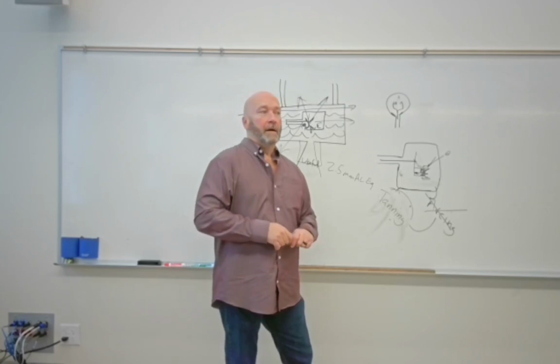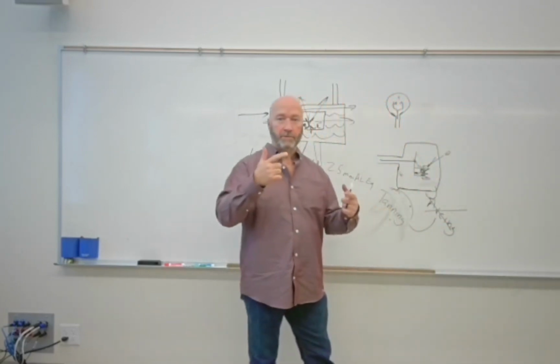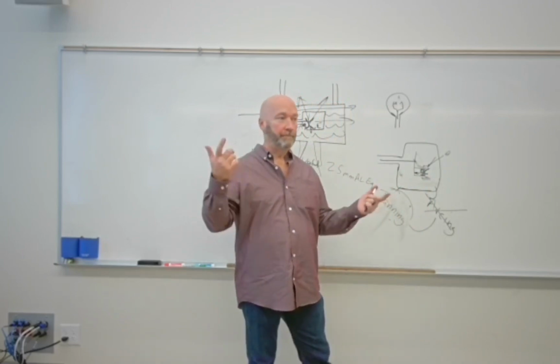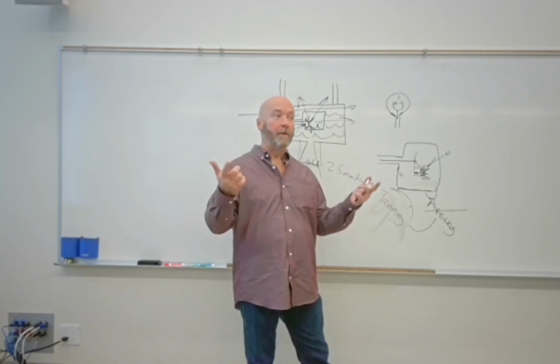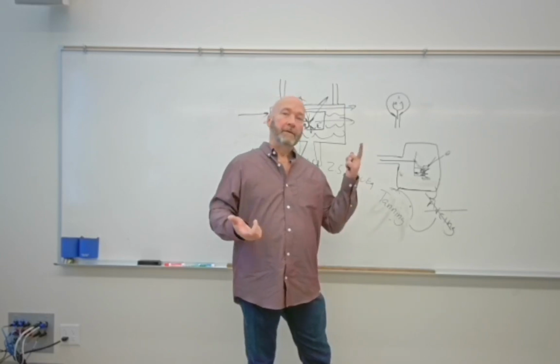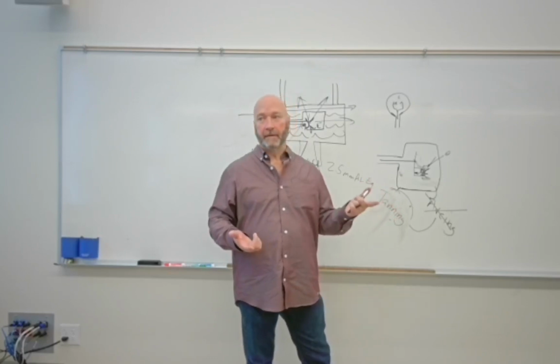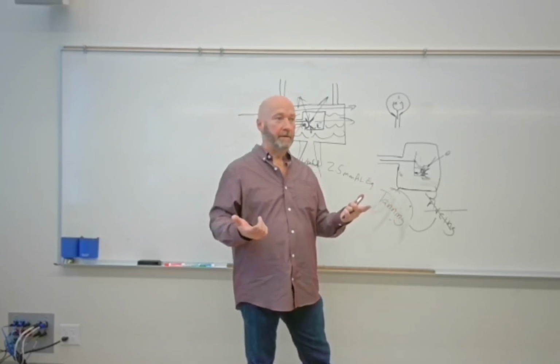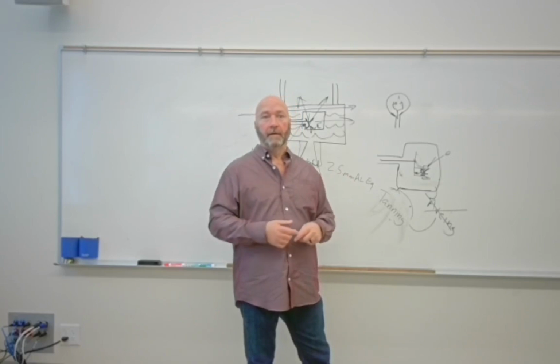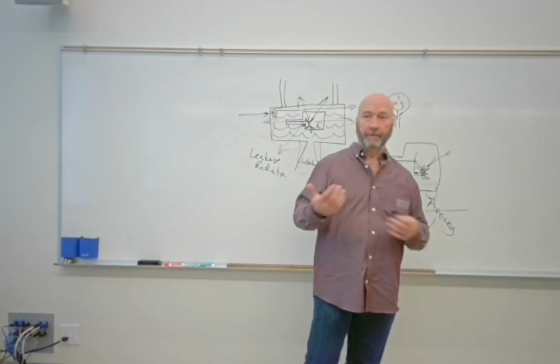People sometimes on test questions will confuse those two things. If your machine will allow you to make the same exposure on large filament and small filament, the output should be identical. 100 mAs is 100 mAs. But if you try to use 300 mA to get to that 100 mAs on a small filament, it's not going to let you make that exposure. That's a totally different thing. That's the difference between 100 mAs and no exposure at all. But if it allows you to make that exposure, there should be no difference in output regardless of which filament you use.